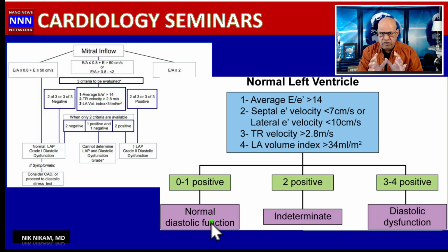In grade 2 diastolic dysfunction, grade 1, everybody knows it's normal. Grade 4, it's like a dead horse. Everybody can identify that. It's the grade 2 where we have some question as to how do we differentiate from mild to a real case of diastolic dysfunction, and that would help us in this particular scenario by looking at these parameters and see how many points they get. If they get 3 to 4 out of these 4 points, then you're dealing with diastolic dysfunction.